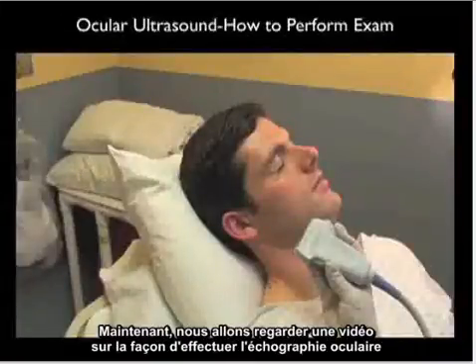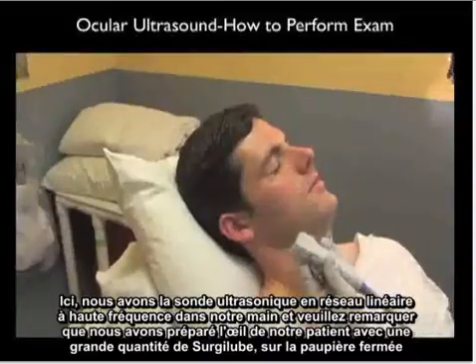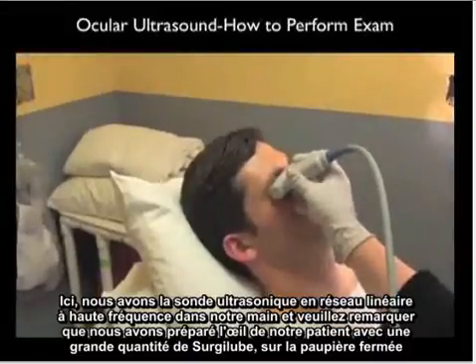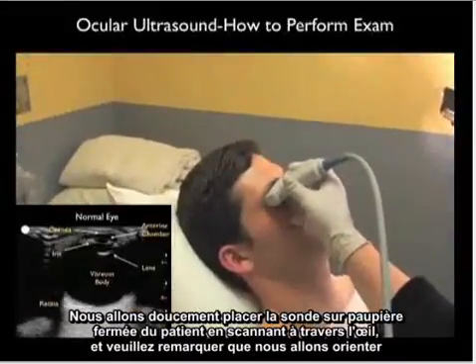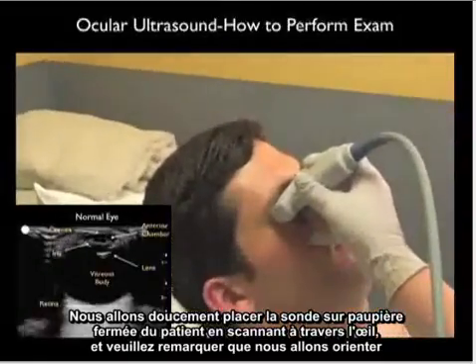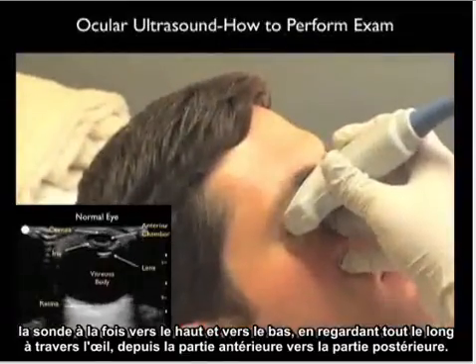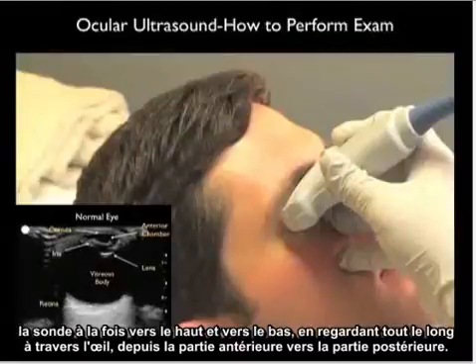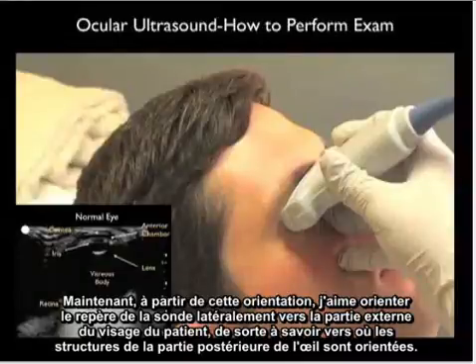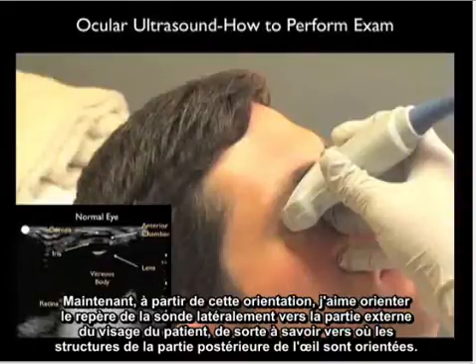Now let's watch a video on how to perform the ocular ultrasound examination. Here we have the high-frequency linear array probe, and the patient's closed eyelid has been prepared with a copious amount of surgery lube. We gently place the probe over the closed eyelid, scanning through the eye, orienting the probe both superiorly and inferiorly to look all the way through from the anterior to the posterior aspect. The probe marker is oriented laterally towards the outer part of the patient's face so we know where posterior structures are oriented.